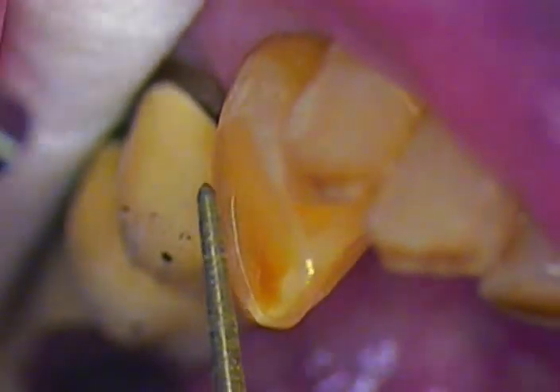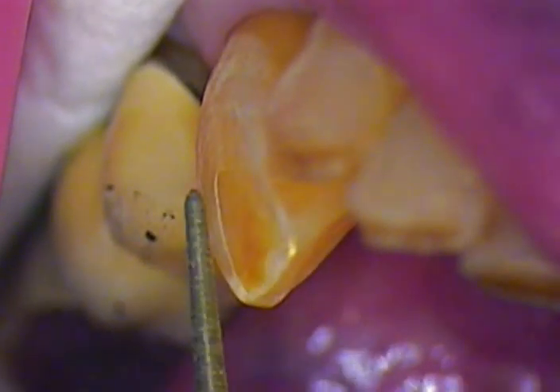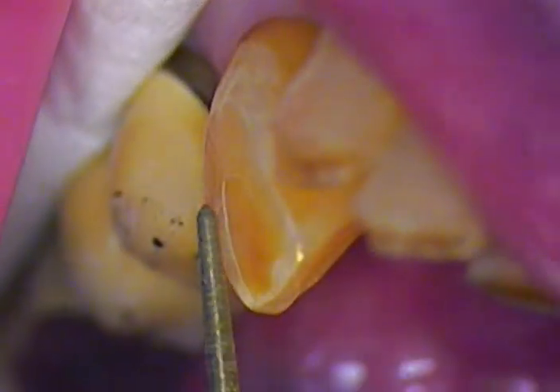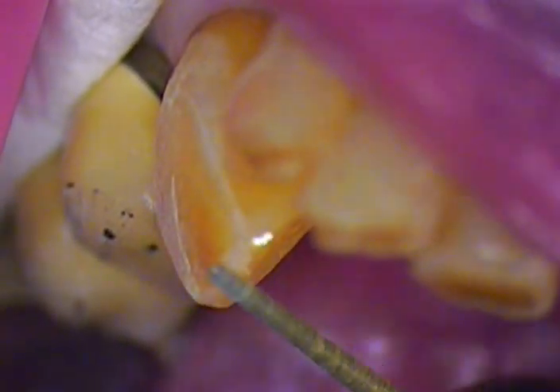Let's go ahead and score the surface of 22 first — just scratch it up a little bit. I don't want to make it any higher on this side in case he has a crossover interference. A lot of you use rubber dams for this. I'm going to be in and out, but I do need to have him close later into his natural bite so I can cure it right where it is. We'll do a little bit of overlapping with material, but I don't want to cause any trauma.